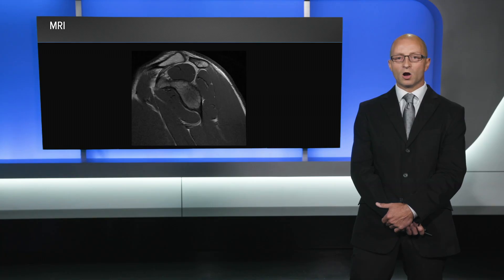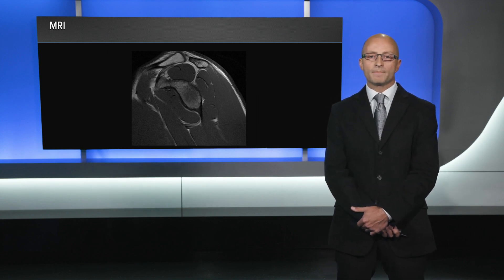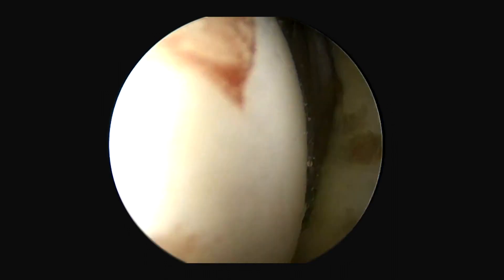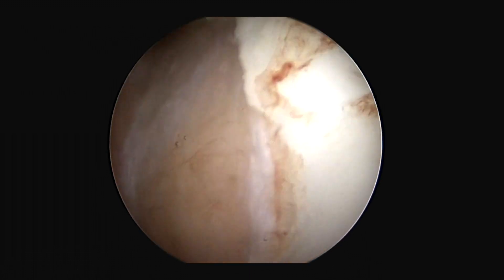So we're going to proceed with an arthroscopic repair using knotless fiber-tack anchors. Here is his diagnostic arthroscopy of the left shoulder, viewed from a posterior portal. You can see his Bankart tear anteriorly, and as we pull posteriorly, we can see his large Hill-Sax lesion.